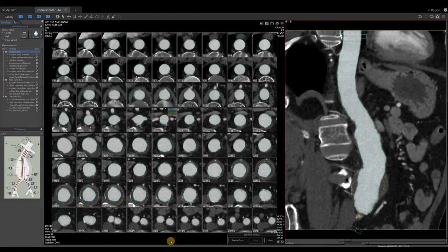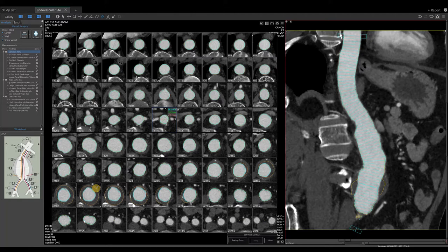A matrix of cross-axial slices is now placed on our screen. These axial slices are perpendicular to the lumen centerline. The lumen contours are identified with a light blue border. The wall contours are identified with an orange border. To focus on just the lumen, in the upper left-hand corner, turn the wall contours off by unchecking the box. Notice the worm-like structure in our CPR image.